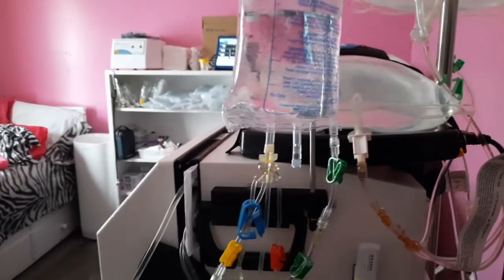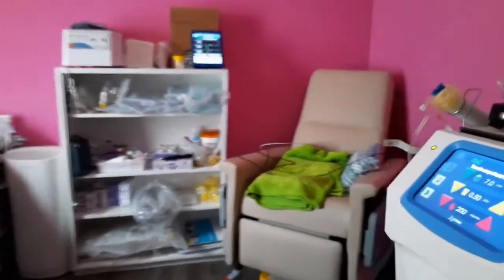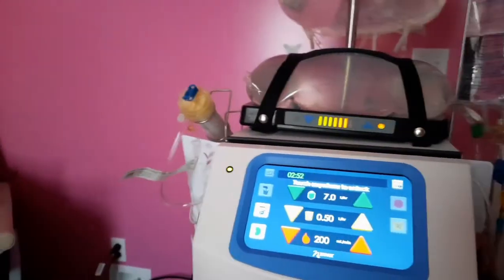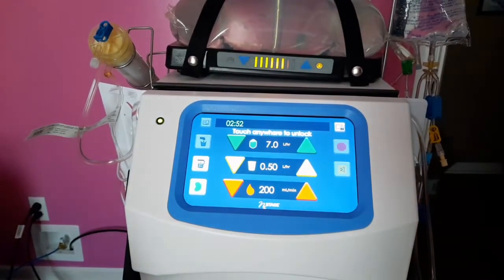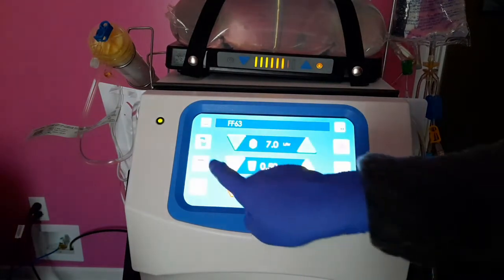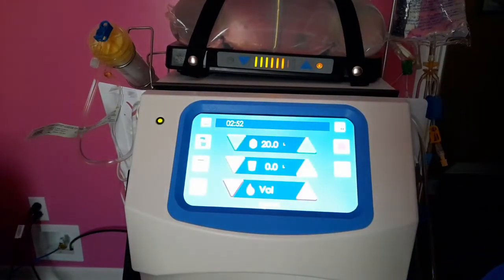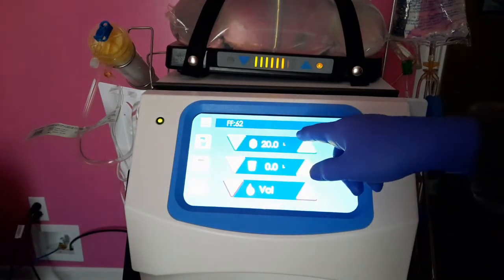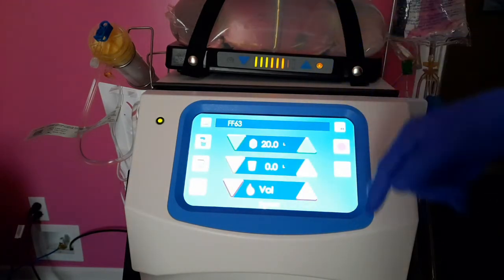So at this point in time, we're ready to cannulize, or cannulate, I think is what it's called. And that means to put the needles in. But before we do that, I have to program the machine. Okay, so this is a toggle button. It looks like a blender. Hit that, takes you to the volume screen. That's your dialysate volume. That's how much dialysate is going to be used. And that's 20 liters. That's four bags, 5, 10, 15, 20.